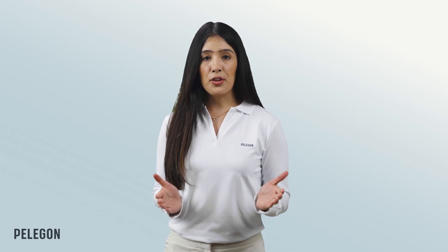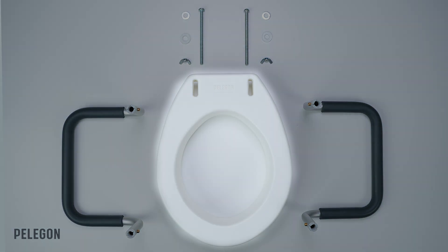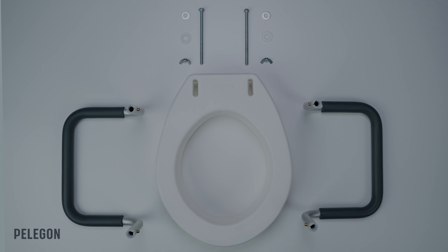Let's display all the different parts in front of us. You have the seat, two hand bars, two metal washers, two plastic washers, two butterfly fasteners, and two long screws.